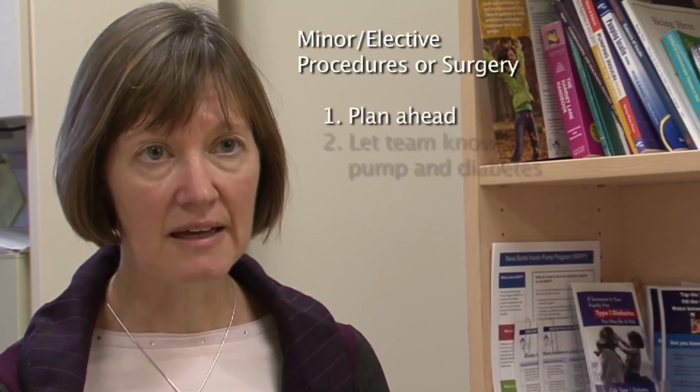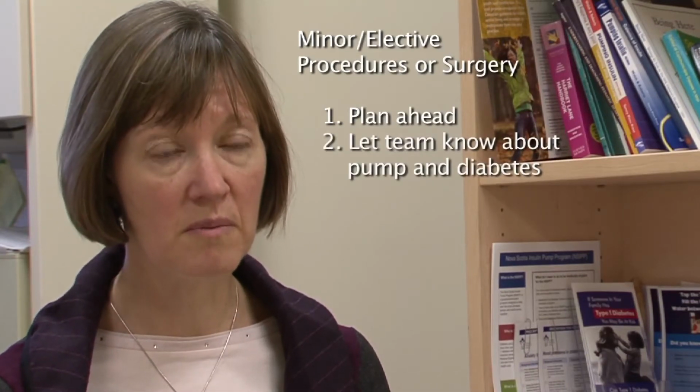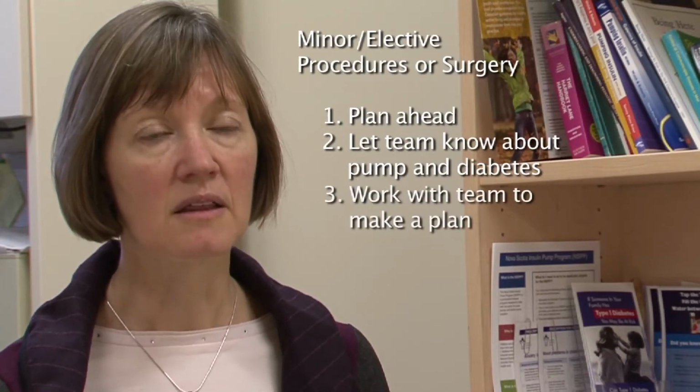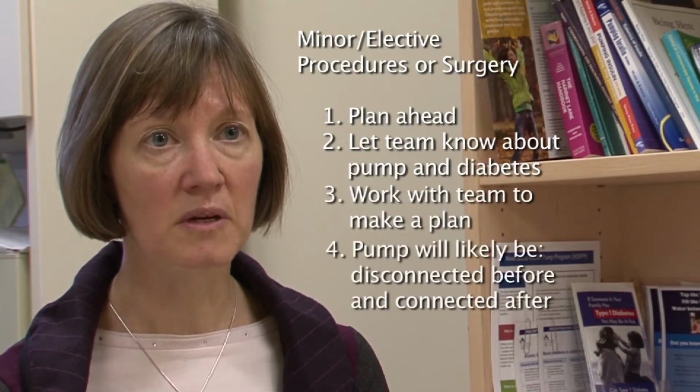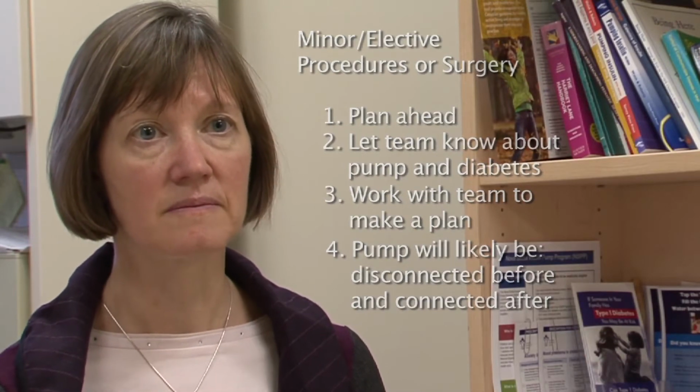In preparing for minor elective procedures or surgery, it's important to plan ahead. Let the healthcare team that's performing the procedure or surgery know about the pump and the diabetes, and work with the diabetes team to make a plan. The most likely plan is that the pump will be disconnected just before the surgery and reconnected just after.